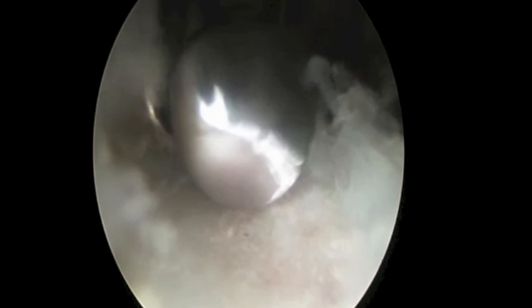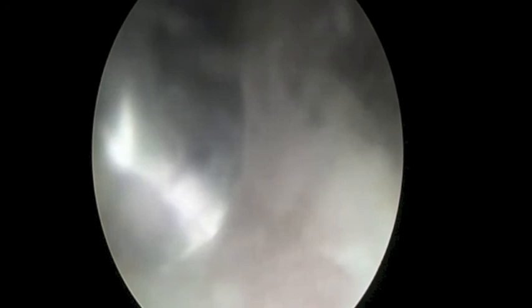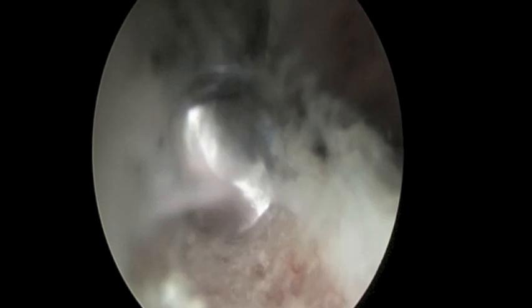In these images we are using a motorized burr to resect the cam lesion on the femoral head and neck. That was the cause of the intra-articular damage, and the point here is to prevent any further impingement in the future.